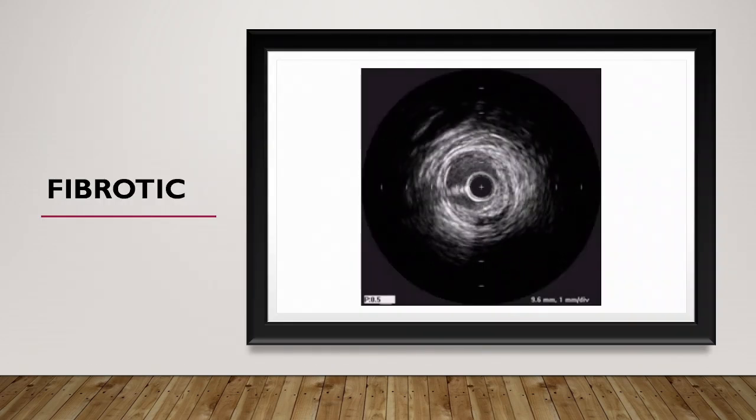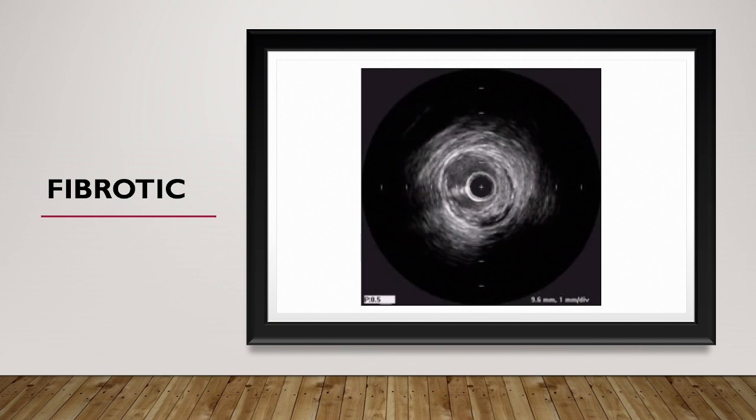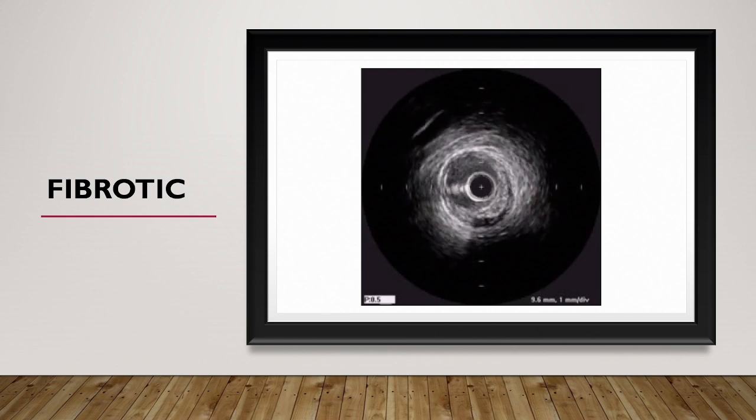Now coming to fibrotic lesions. Fibrotic lesions are the lesion morphology where the tissue texture or the echogenicity of the tissue becomes identical to the adventitia. It's not that bright like calcium. It is allowing your ultrasound to penetrate. You can see the surrounding tissue. It's similar. So that is a fibrotic tissue.